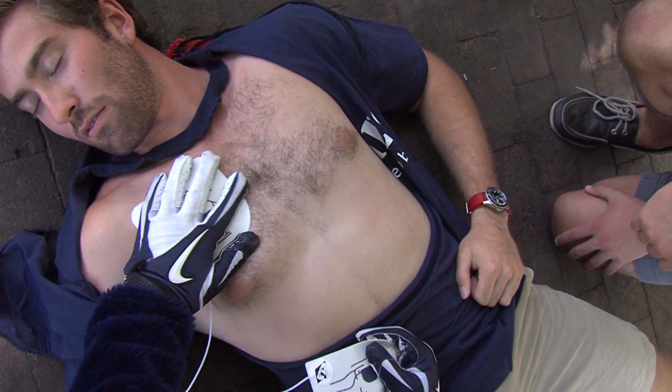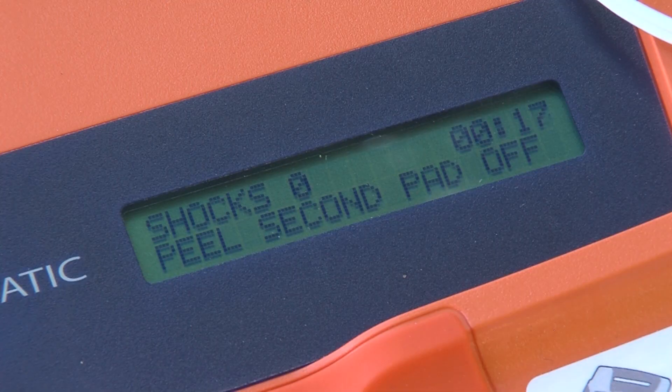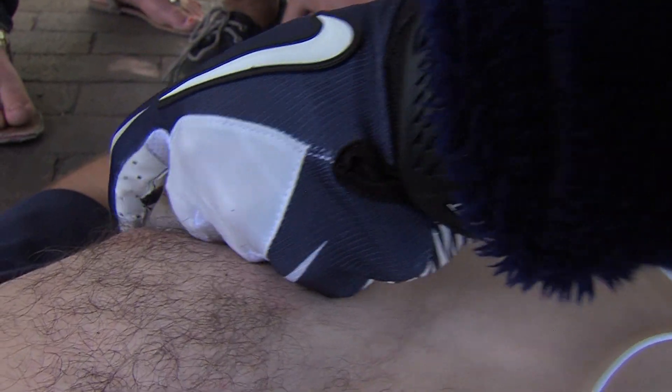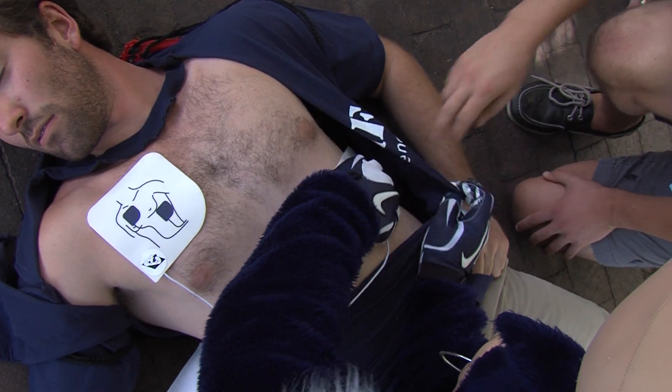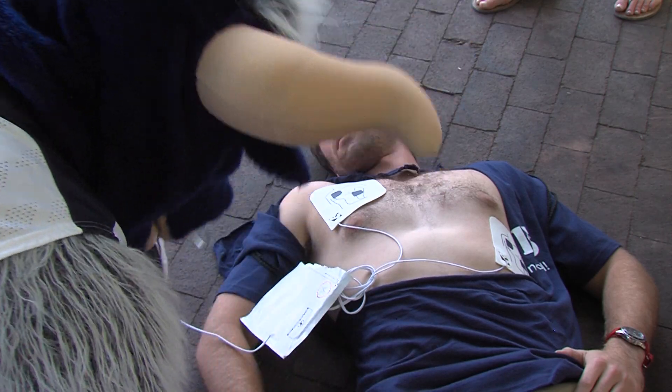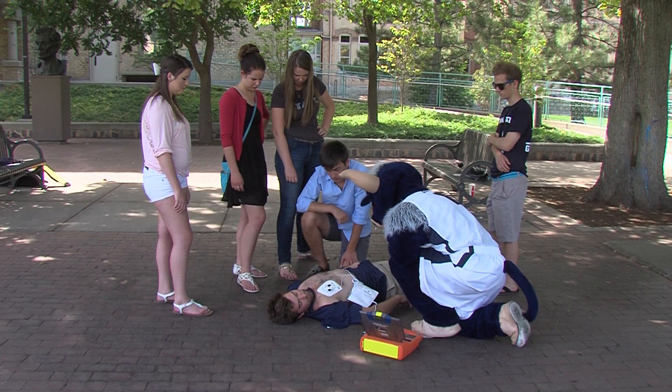This pad can be placed on either of the two locations shown. Next, peel the blue plastic liner off of the second white pad. Firmly place the second pad on the opposite location, exactly as illustrated. After you place the pads on the victim, the AED will monitor the heart rate and decide whether to shock or not.